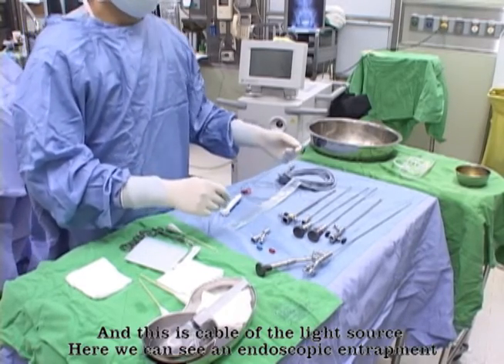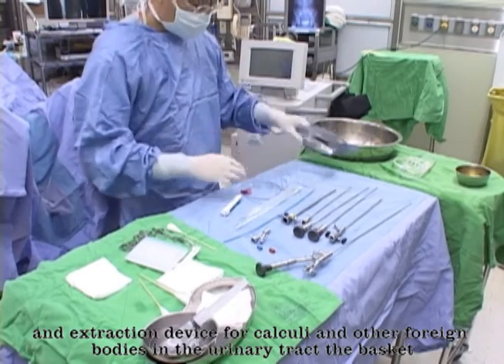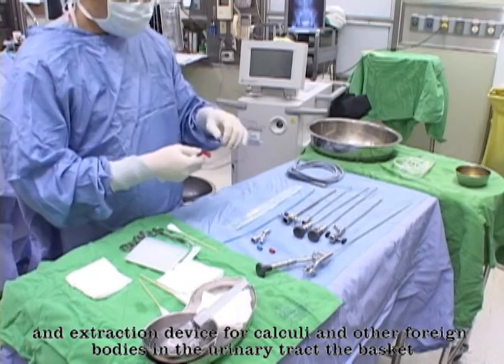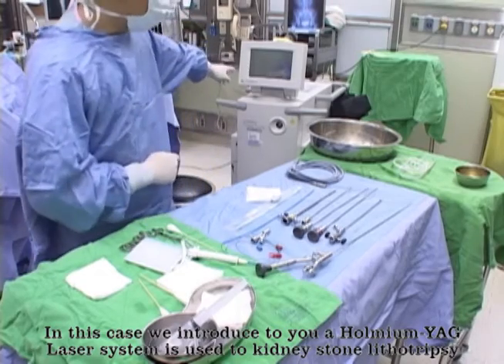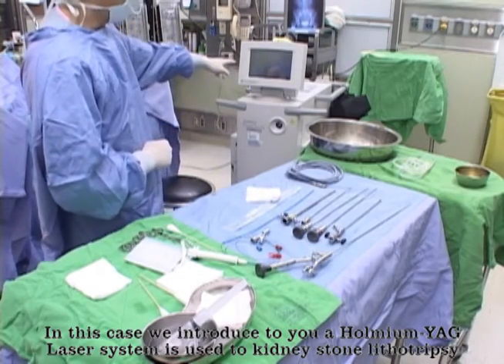And this is a cable of the light source. Here we can see an endoscopic entrapment and extraction device for calculi and other foreign bodies in the urinary tract — the basket. In this case, we introduce the Holmium YAG laser system, which is used for kidney stone lithotripsy.